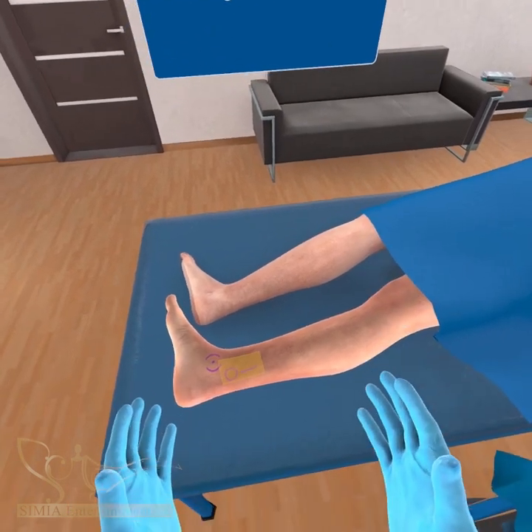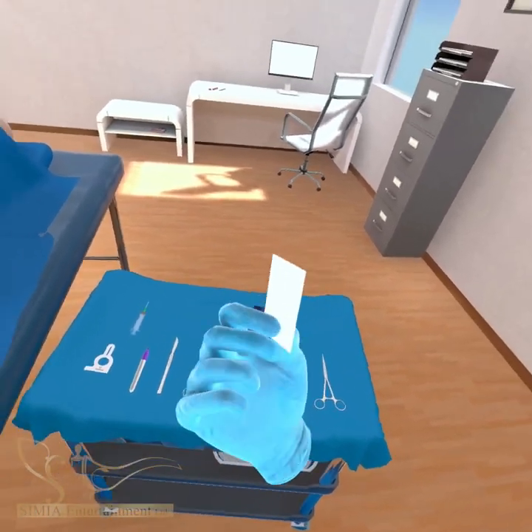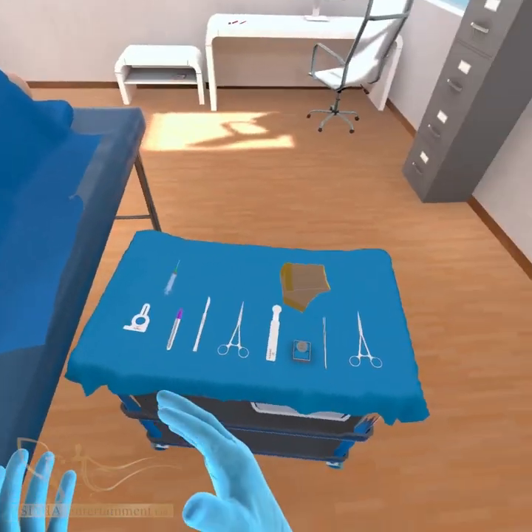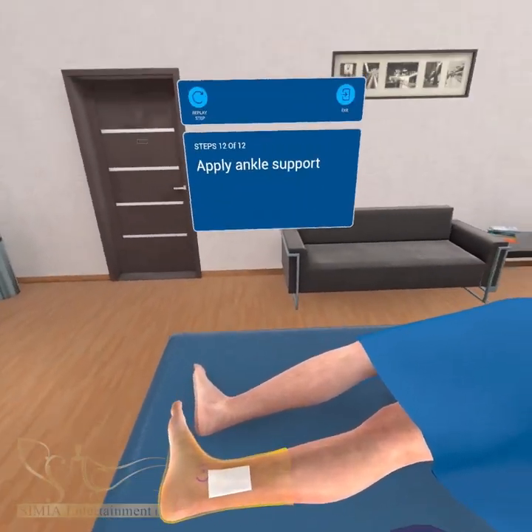Place the Tegaderm dressing after the dermabond is dry. Apply the appropriately sized ankle support with no wrinkles and the ability to fit one finger underneath.